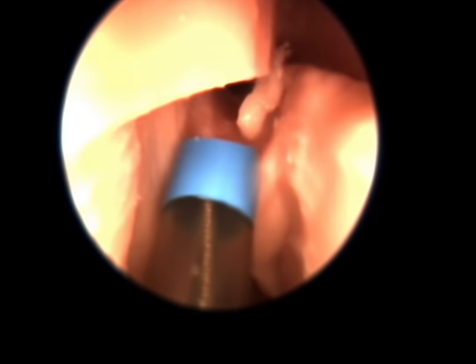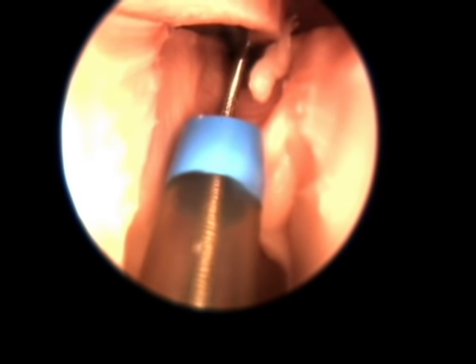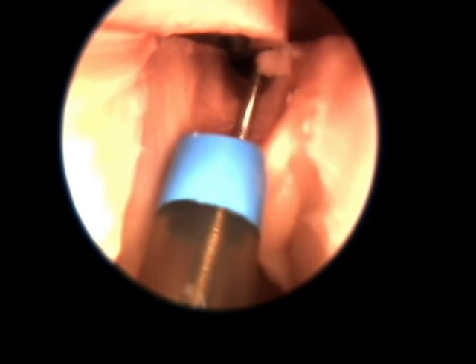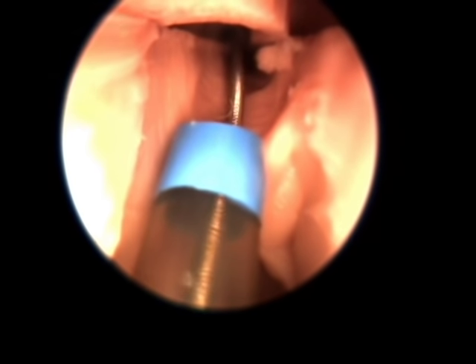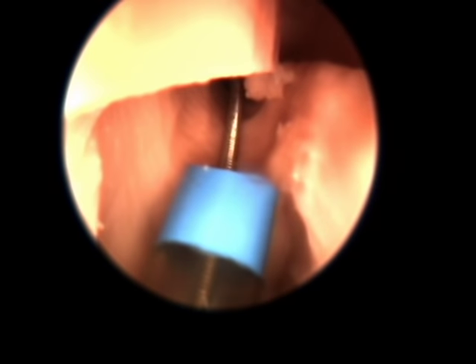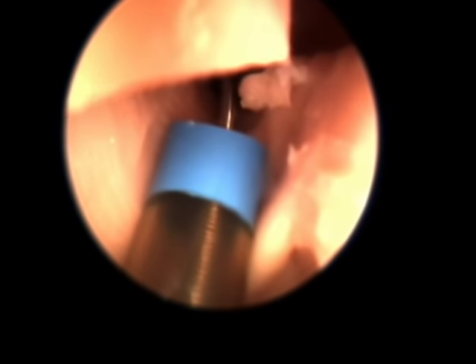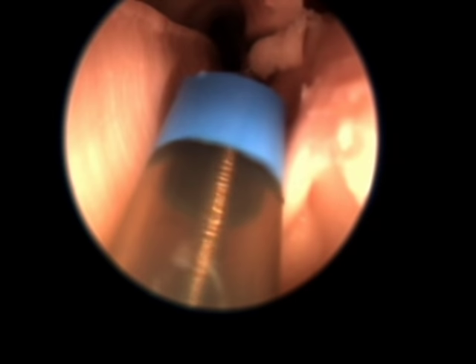The guide is being positioned to allow a probe to identify the opening into the right frontal sinus. When the opening of the right frontal sinus is identified, the guide wire is then threaded completely into the sinus cavity. The balloon catheter is then threaded through the guide, following the path of the guide wire into the frontal sinus cavity.